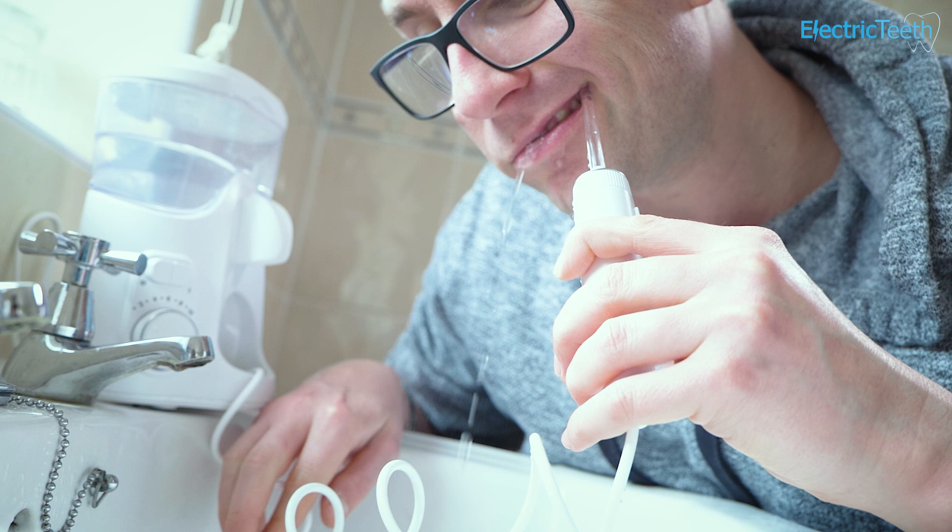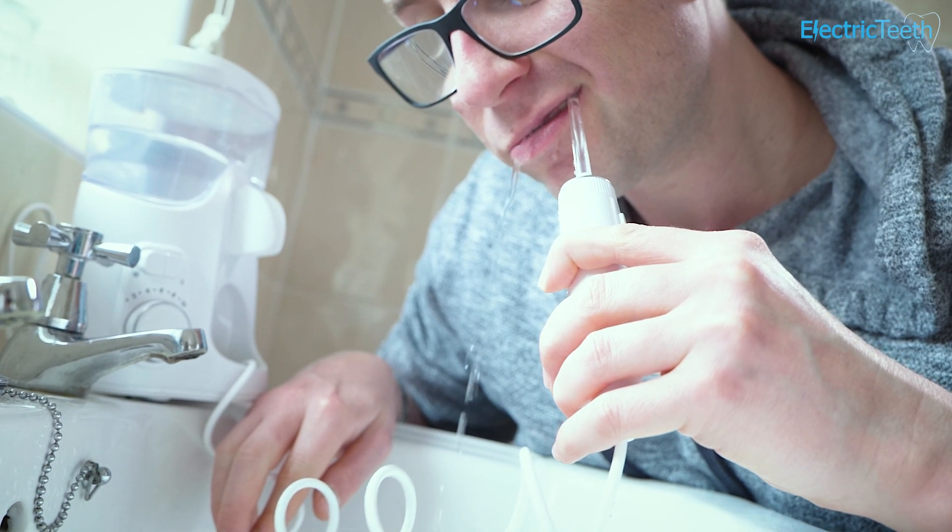I use this before actually brushing my teeth and it's amazing just how much it manages to flush out — and that's just the stuff I can actually see.